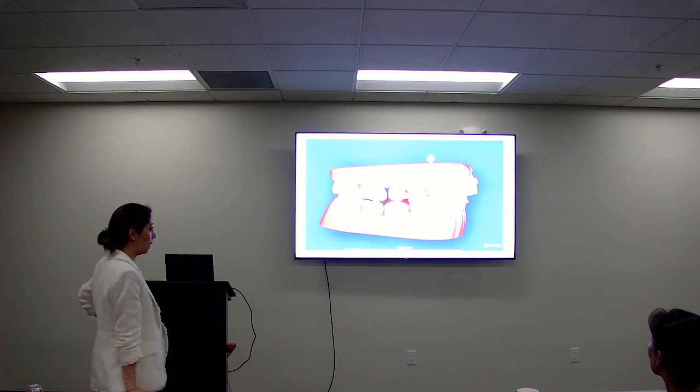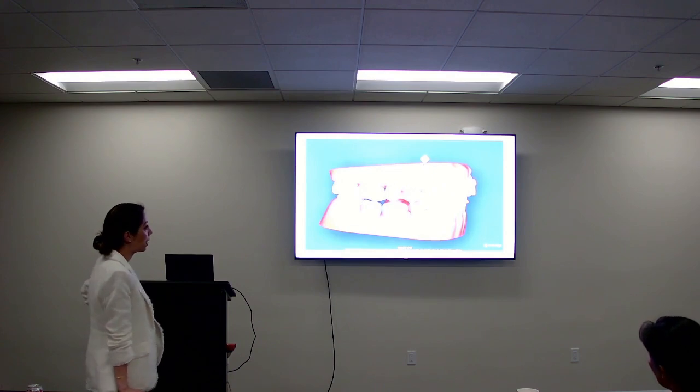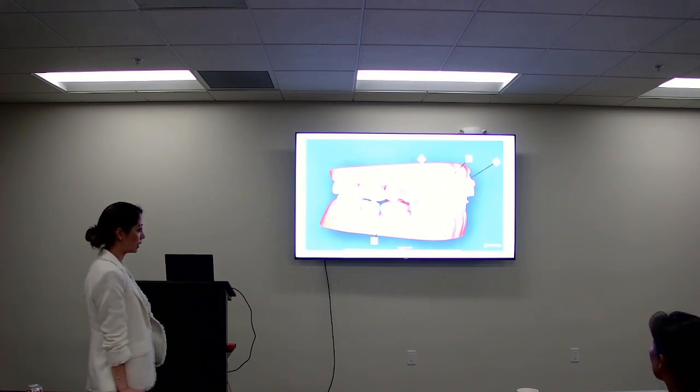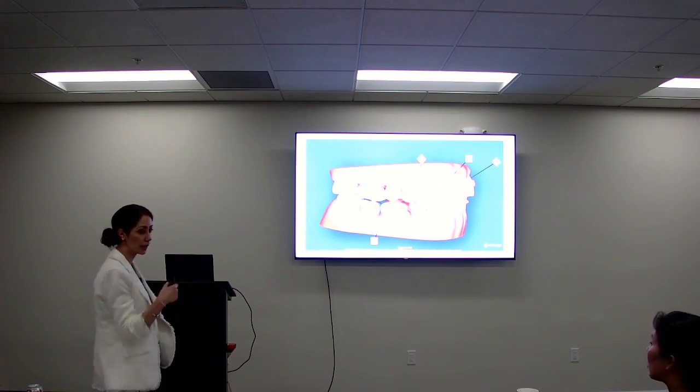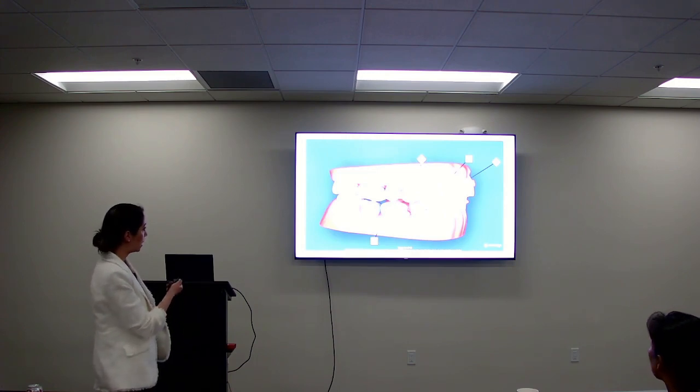And we put this Pontic paint. We don't put Pontic paint in the posterior Pontics, but we put Pontic paint on the anterior Pontics. And this paint by Reliance is like a little resin you put into the aligner and then you cure it. It's like one shade fits all, or maybe it comes in different shades. I don't know. We only order one shade.